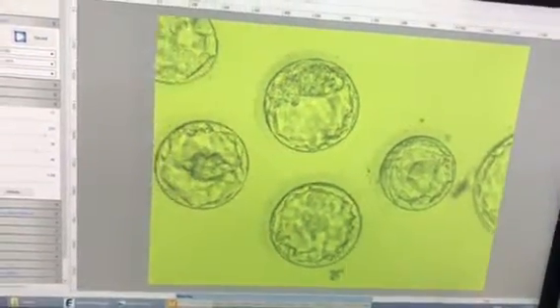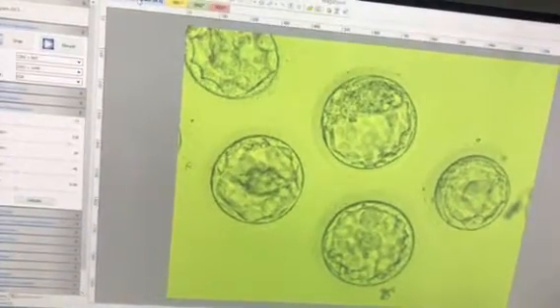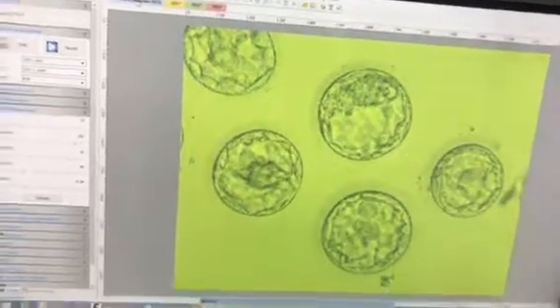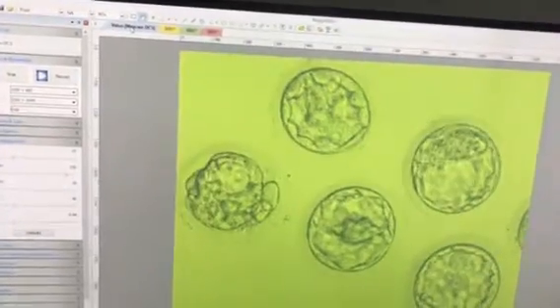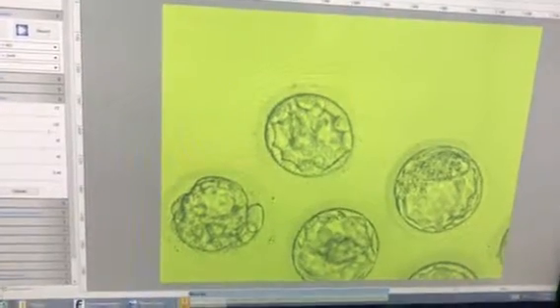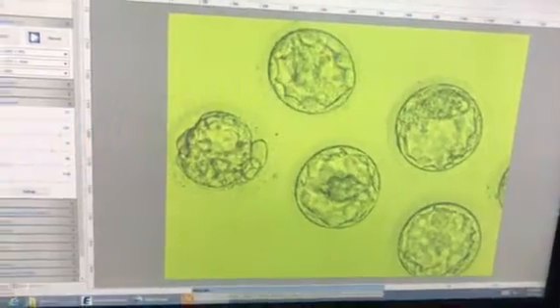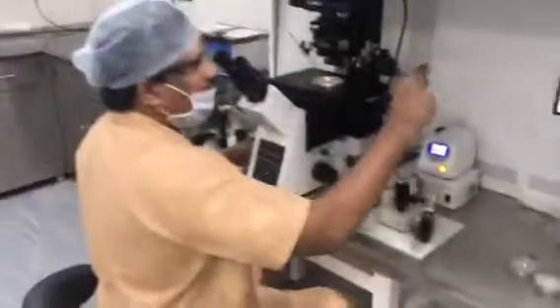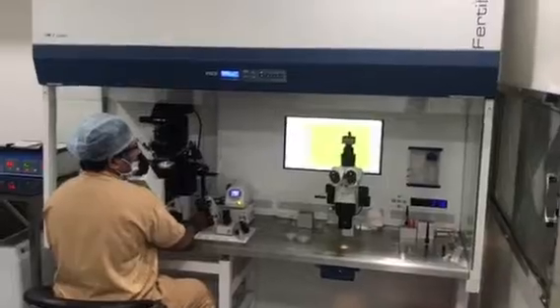So we have 3AA, 3AA, then the upper one is a 3AB and 2AA, then it is an early blast, little bit poor quality. So we will eliminate 2 blastocysts and go with the rest. The poor one will go out and the one in the middle will be eliminated.